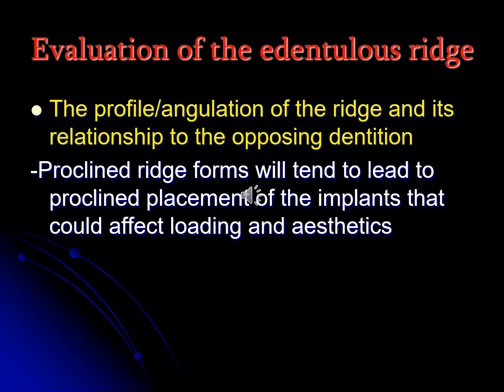The ideal solution for this problem is to prepare and design the prosthesis first, and our implant must follow the final prosthesis, not follow the bone, because if we follow the bone, we will have a bad result aesthetically and functionally.